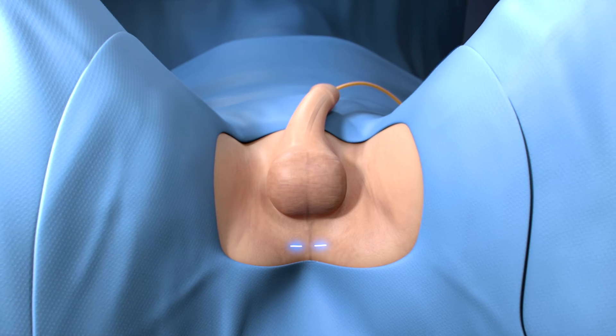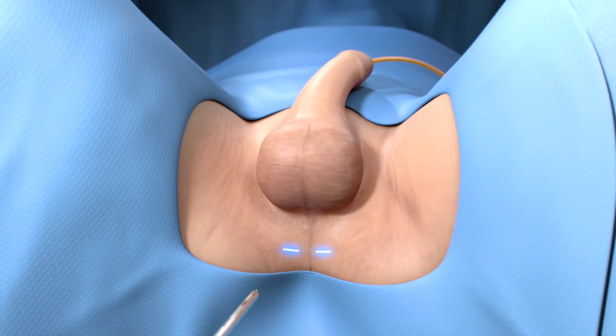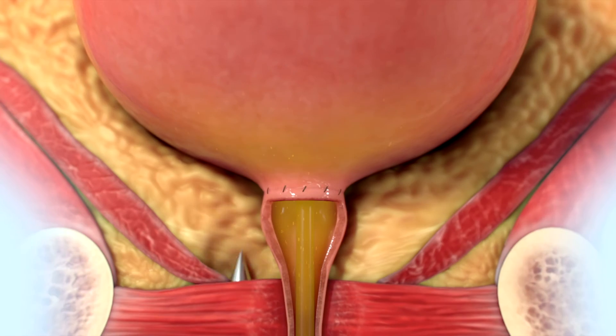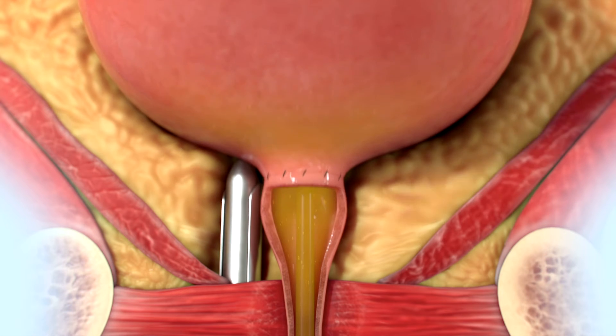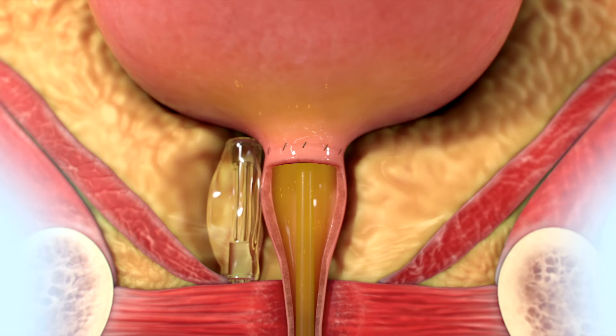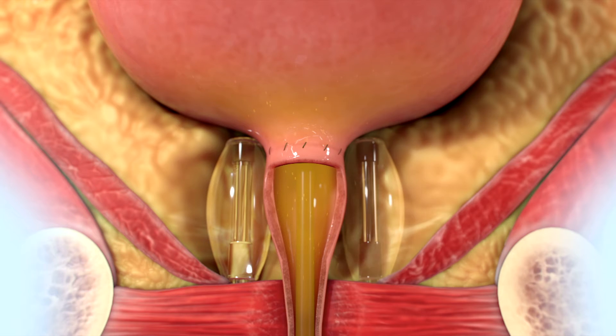The PROACT devices are placed through two small incisions underneath your scrotum. A delivery tool is inserted through the incision and guided to the location your prostate was removed. A PROACT device is delivered through the tool and inflated with a small amount of fluid. A device is then placed on the other side of your urethra and inflated.